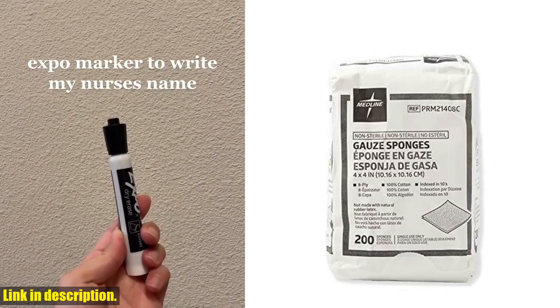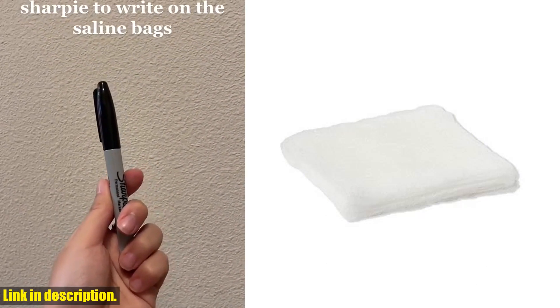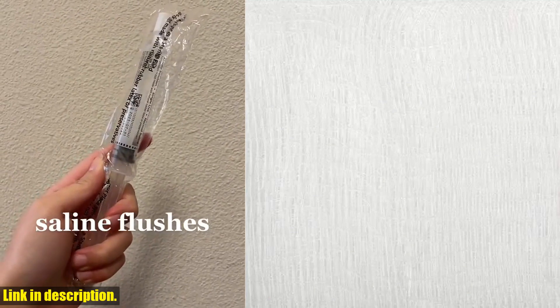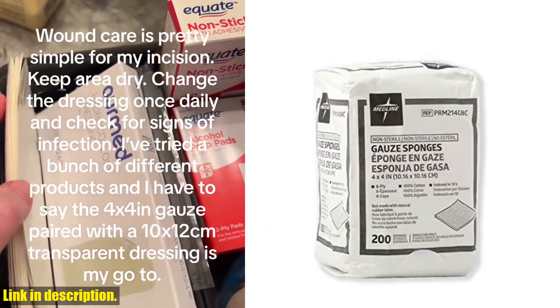Today, I wanted to talk about something that may seem small but is actually a huge game changer when it comes to wound care. I'm talking about the Medline 4x4-inch gauze sponges. These non-sterile, 100% cotton, woven gauze sponges are an absolute must-have for anyone who takes wound care seriously.